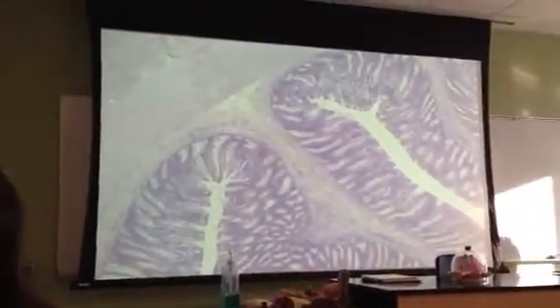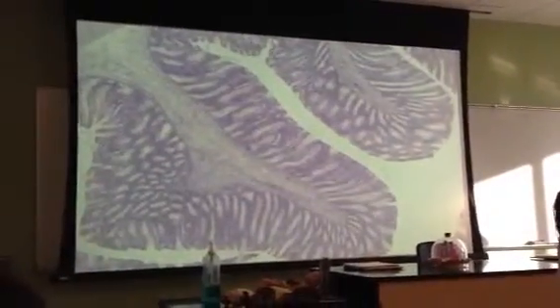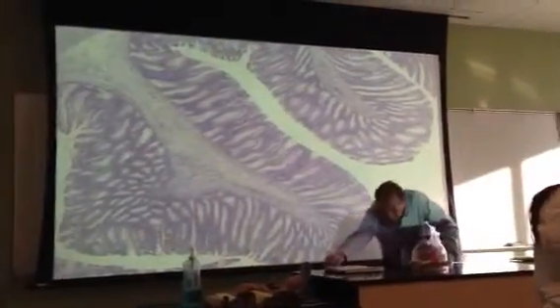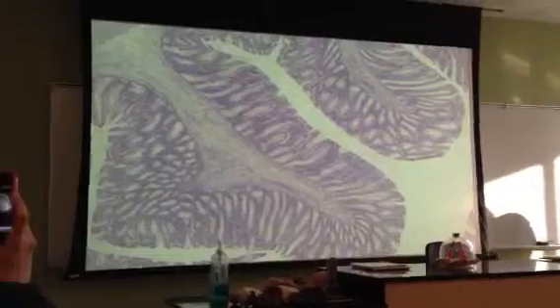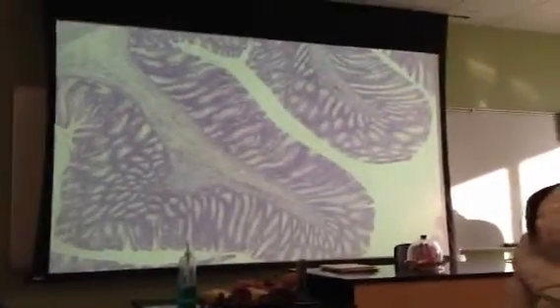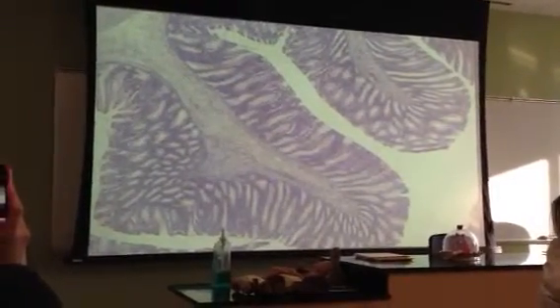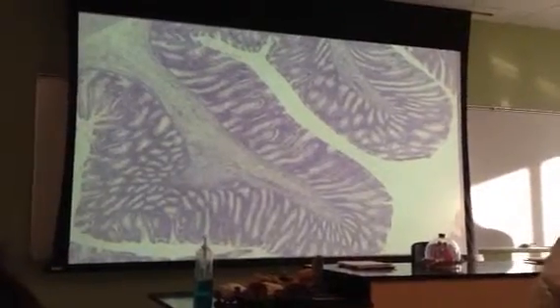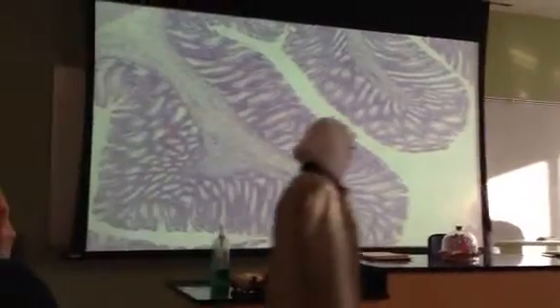This is only a piece of a colon. So it gets chopped here. You can't see a whole lumen, but all this white area here, this is a lumen. Okay? Goes in there, etc. Mucosa in general, this might be confused with the stomach, especially since there are folds which resemble rugae. They've got these big things.